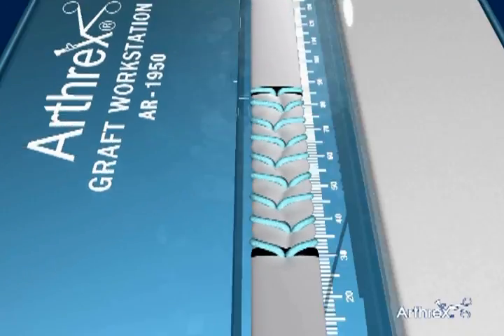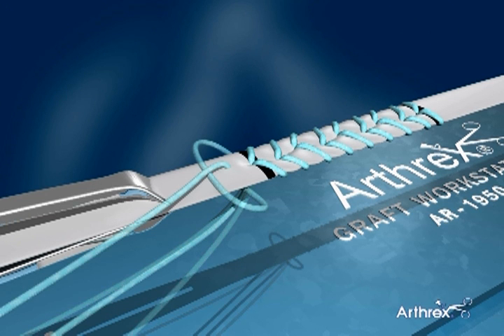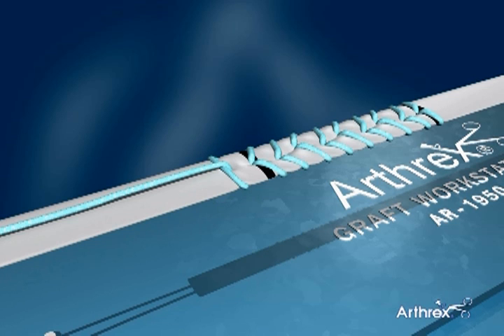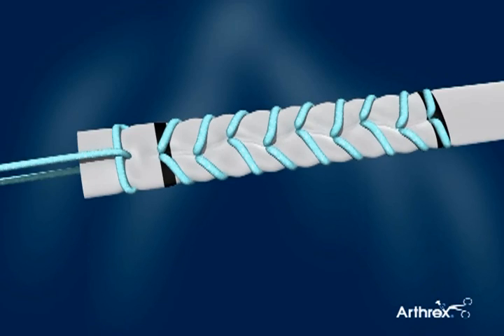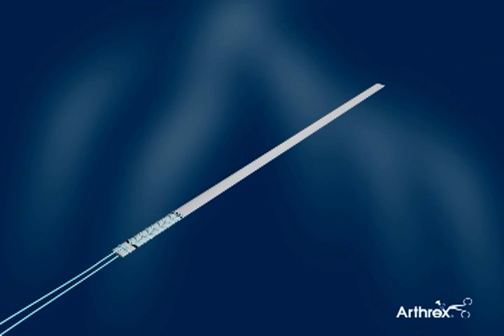The technique is repeated to the marked end of the tendon. A final collaring stitch may be applied to squeeze and taper the graft tip, leaving one suture tail exiting each side. Trimming the tendon to its exact final length is best done after completion of the speed whip technique.